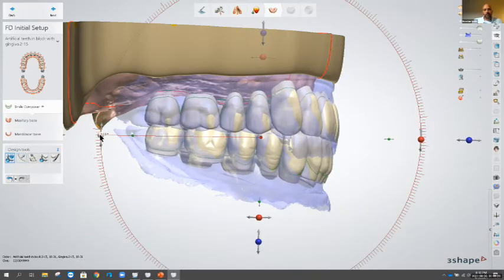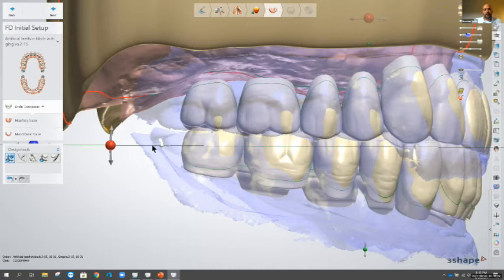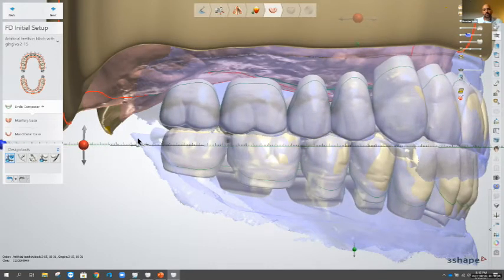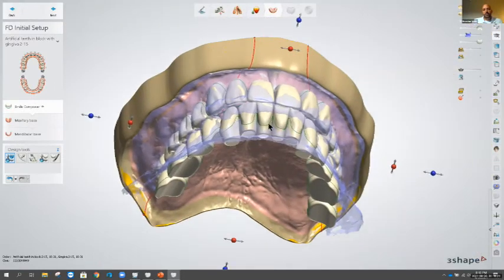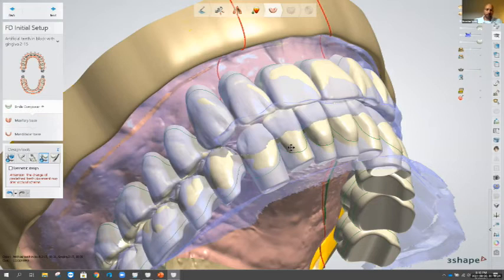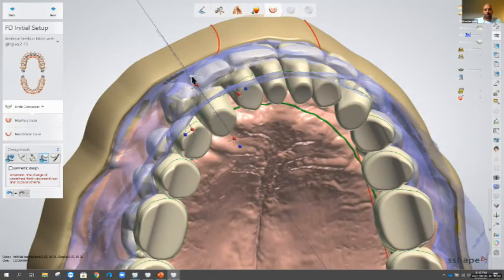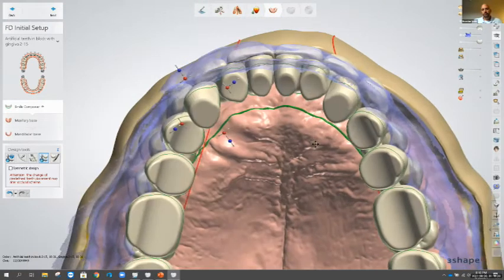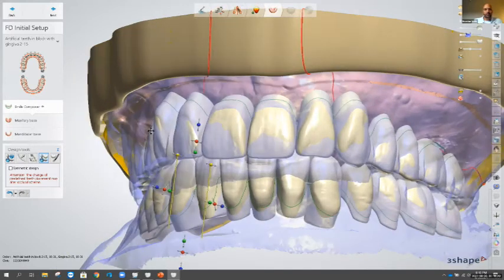So if I notice that maybe my proportions are slightly off, so I can see that my posterior isn't following, I can enlarge these back so that they're a little bit bigger in the posterior. That's one of the advantages of designing your own teeth. I can make minor changes to the teeth, positions, rotate teeth if I need to, reposition things, and adjust the overall occlusion if I want. So that looks pretty good from this tool.